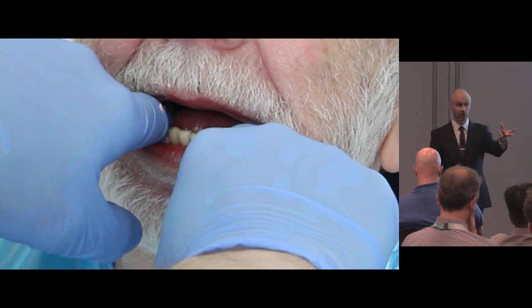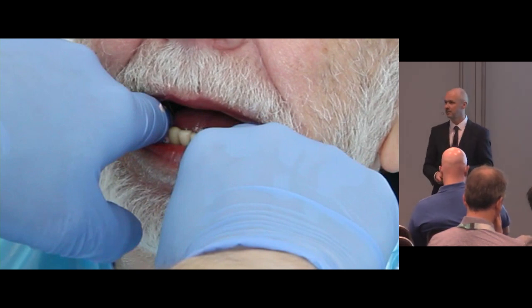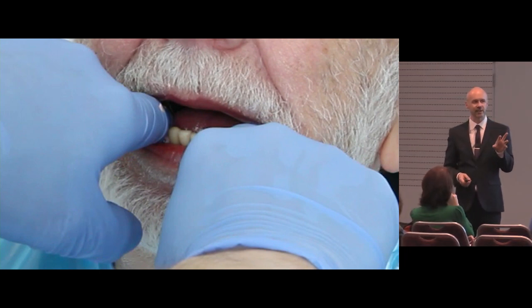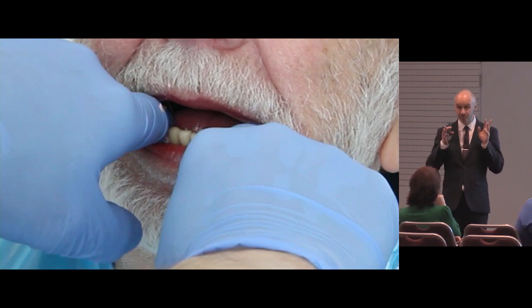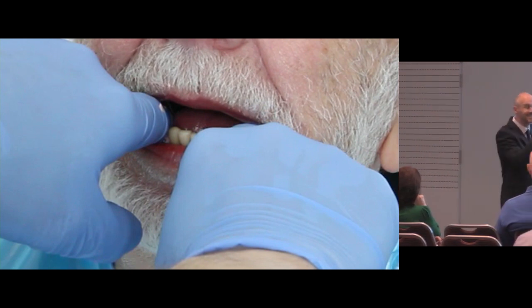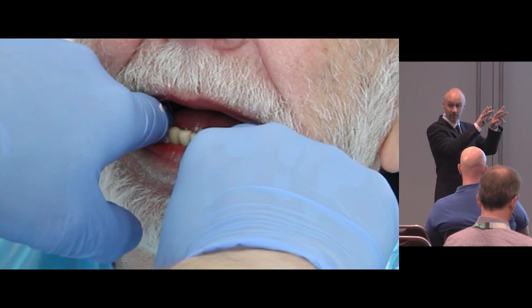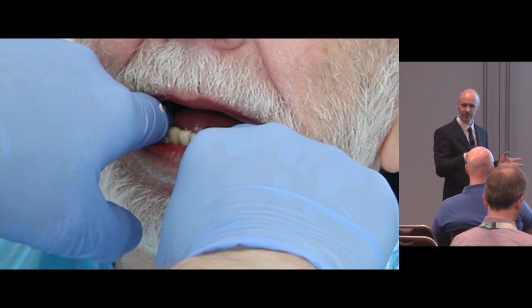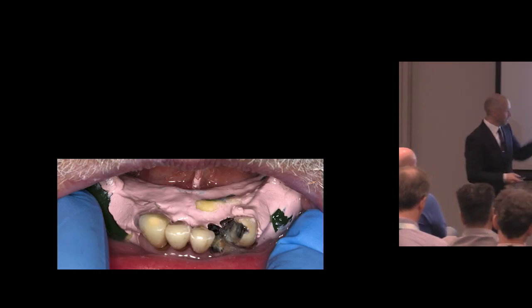And it's all a border-moulding approach, and we found it really does help with generating some form of suction. But I think this suction thing is not as important as stability. The stability that I get with these dentures is way better than what I used to get when I just extended it halfway up the retromolar pad. Now I go right up and over, then the whole denture stays put better, by the soft tissues draping. It's like a sandbag, if you will. So, right.